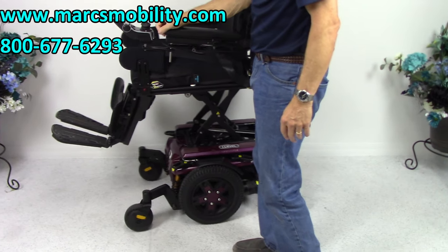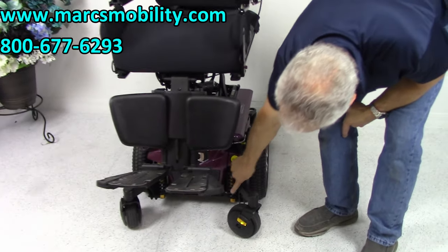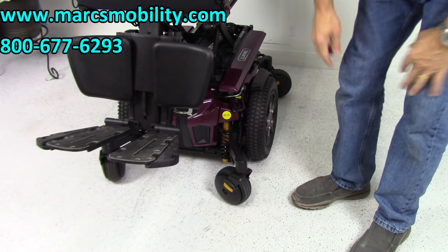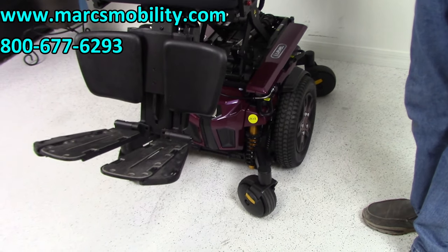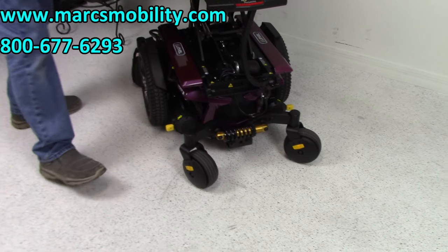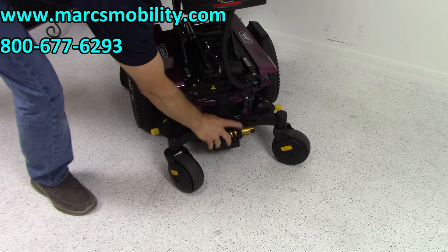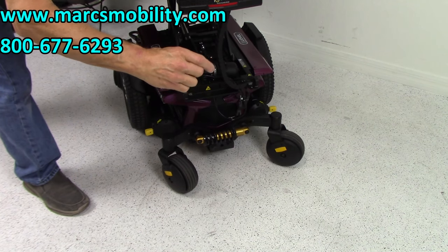I want to show you the suspension on this chair. Look at the suspension in the front — look how large it is on both sides. Great looking, heavy-duty suspension. And you have the same suspension in the back as well — two of these up front. You can adjust it by turning this ring right here to make it tighter or looser.